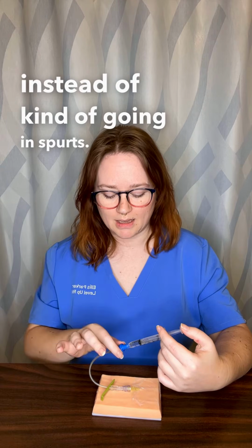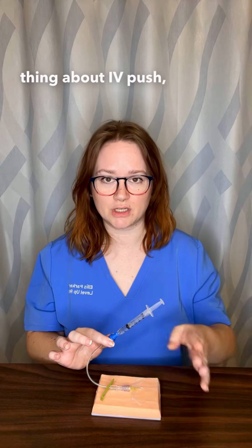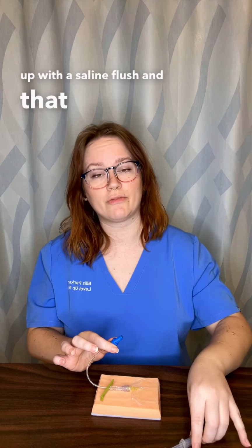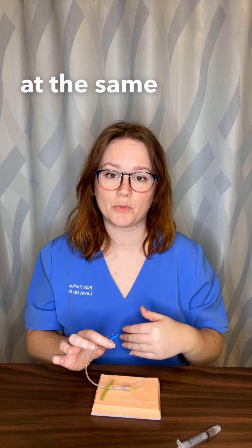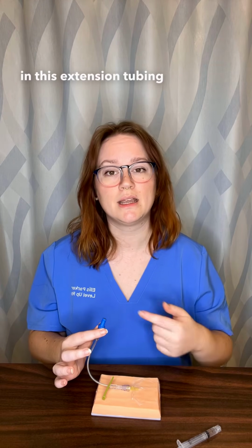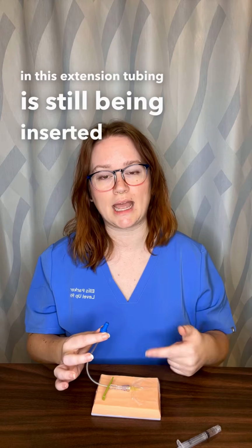And one final thing about IV push, I'm going to follow this medication up with a saline flush, and that flush should be administered at the same rate so that the medication that is remaining in this extension tubing is still being inserted at the correct rate.